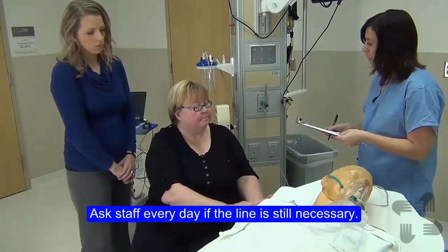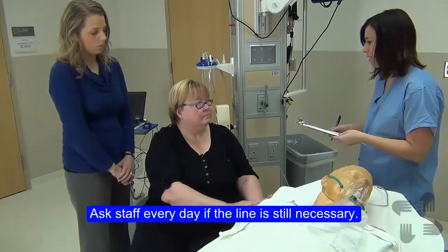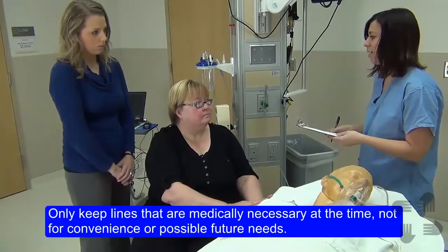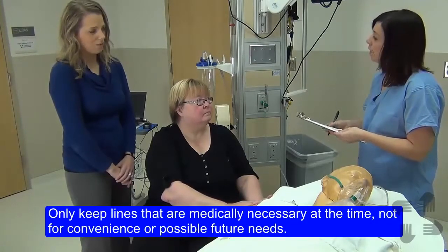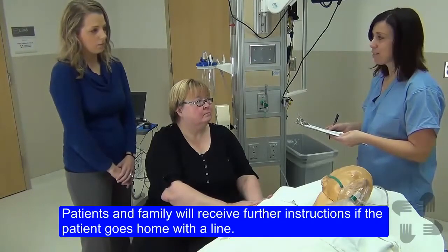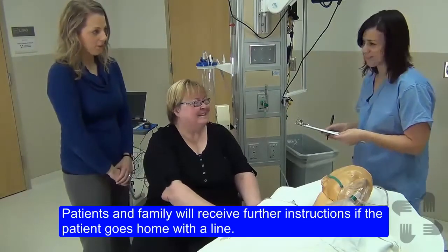And then it would be wise to go ahead and ask, how long do we need to keep this in? So we like to keep these lines in as long as they're needed. And as soon as they're not needed, as soon as we can take it out, the better. If he does go home with this line, we've got lots of other instructions. So we'll just wait and see how his condition goes. Thank you.